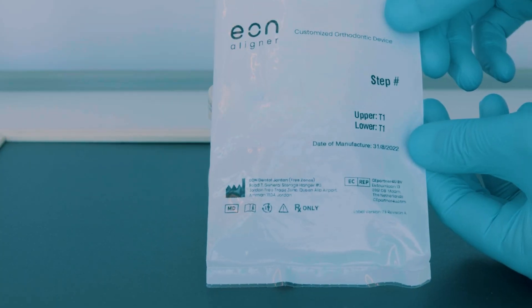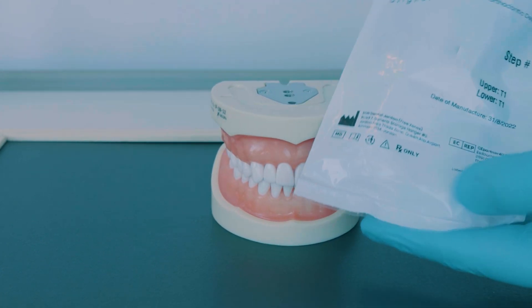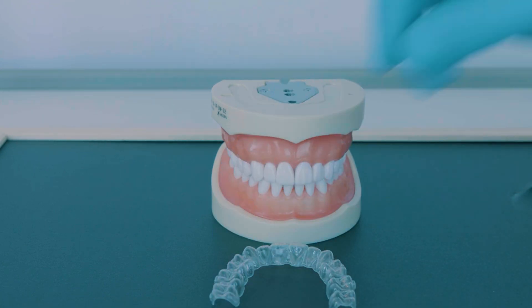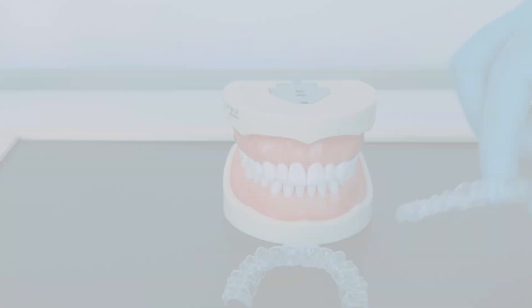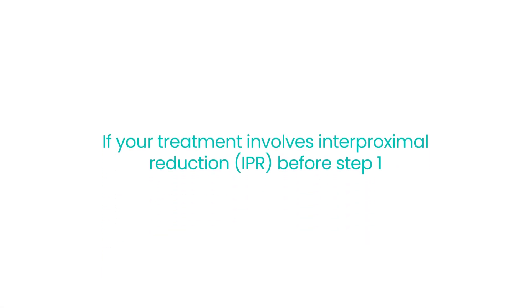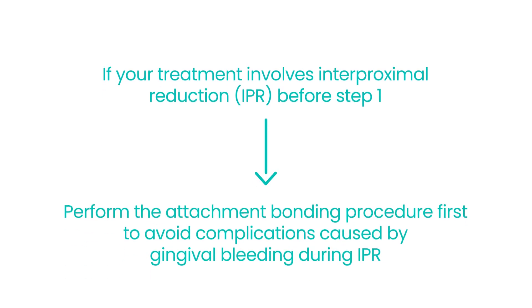To place attachments, you will receive an attachment template along with the aligners package, placed in a separate pouch marked as T1. The number indicates the step at which the attachments need to be placed. If your treatment involves interproximal reduction before step 1, we recommend performing the attachment bonding procedure first to avoid any complications caused by gingival bleeding during IPR. Now, let's get started.